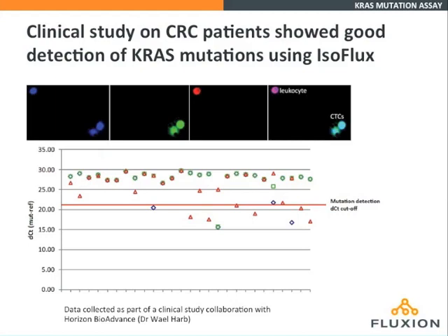One is that all patients that were healthy controls were not positive for any mutations. Also, patients that showed zero CTC counts in matched samples did not come up with a mutation. So those are nice negative controls. Now, of the rest of the patients, we see sort of what we expect, which is that a significant fraction of the patients present mutations, and that matches literature values in terms of percentages.